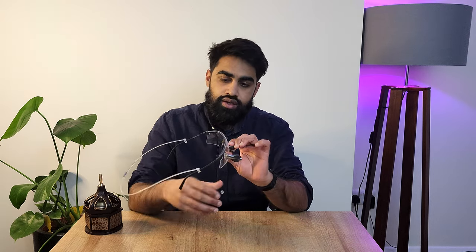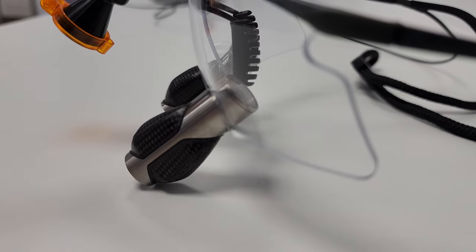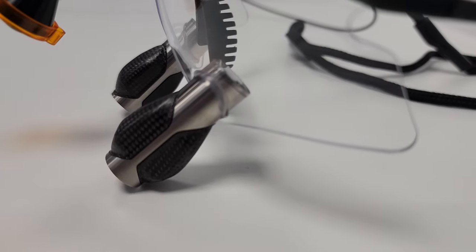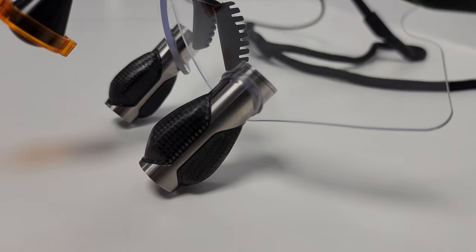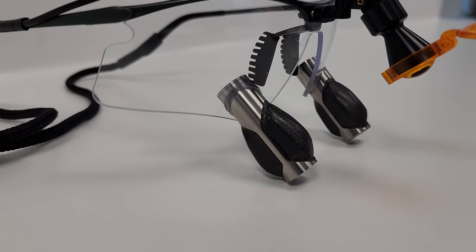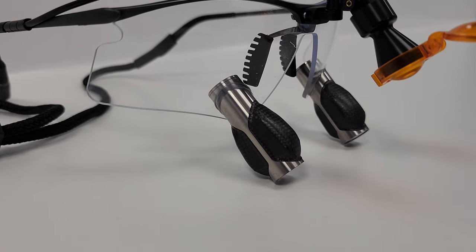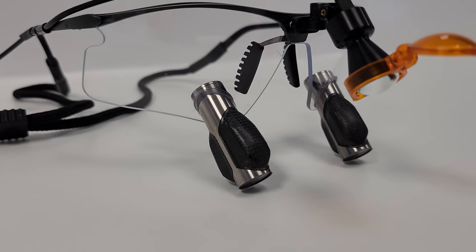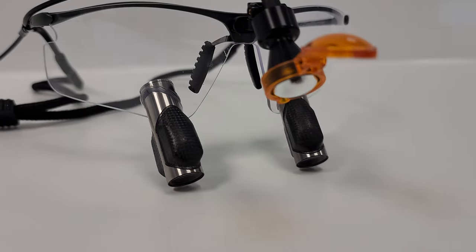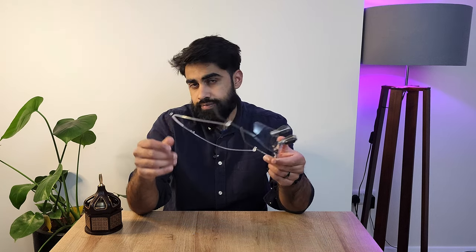The loupes themselves I personally think are one of the best designed and best looking on the market. I really like the metallic finish and the carbon fiber pieces attached to them — very elegant and sleek, very inconspicuous, not too bulky. It didn't really affect my field of view much either. These are four times magnification and I wasn't thinking I needed a wider field of view, so I was pretty happy with that.